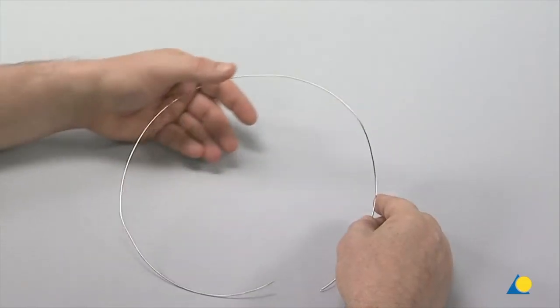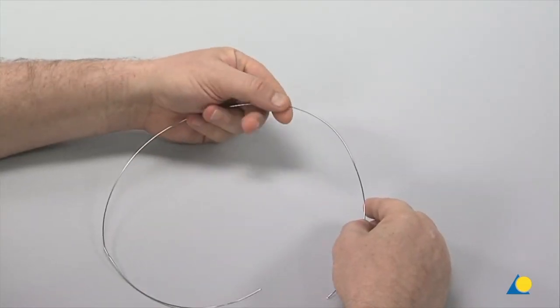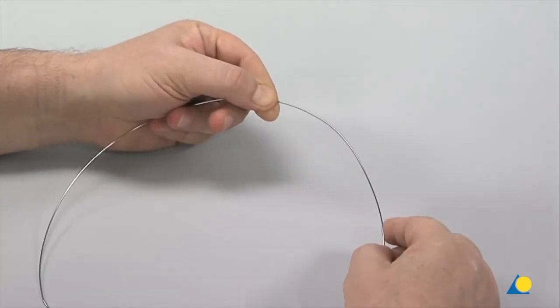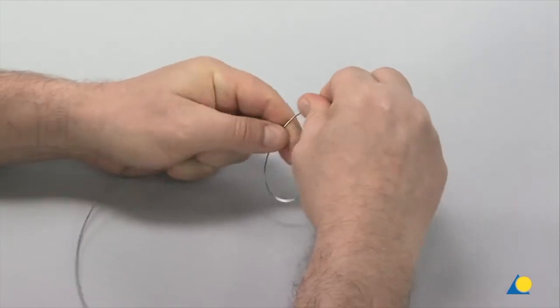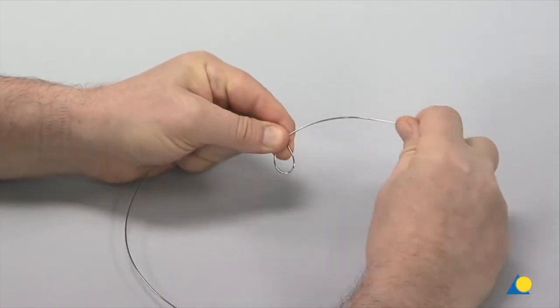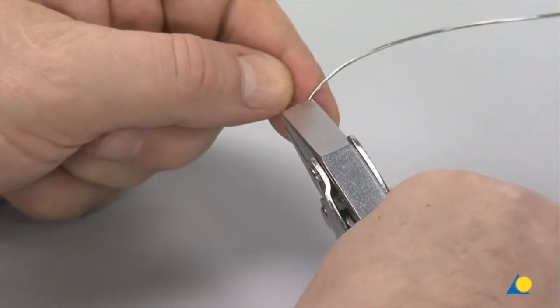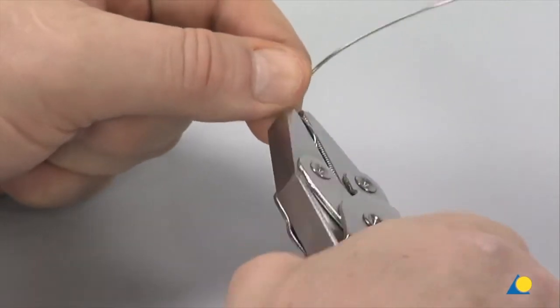A piece of 1mm circlage wire roughly 50cm long is cut from the coil. A loop is made by hand, approximately 1 third along the wire. The loop is then twisted with the flat-nosed parallel pliers.